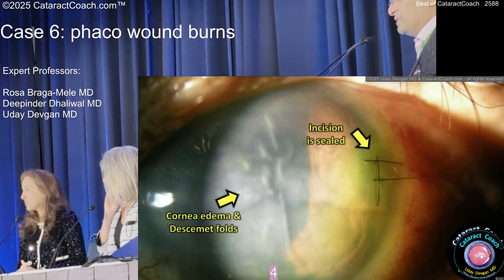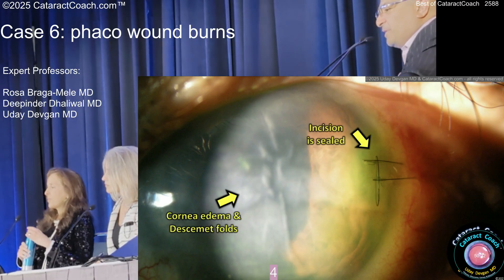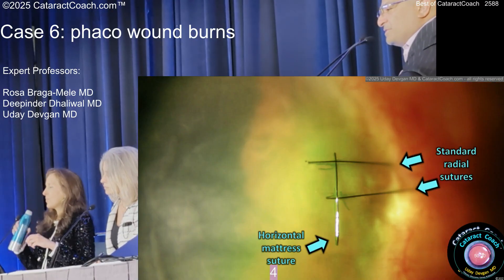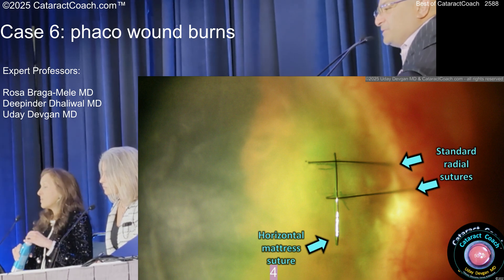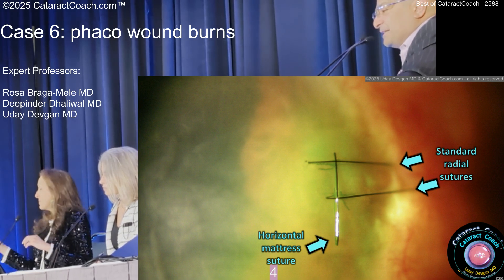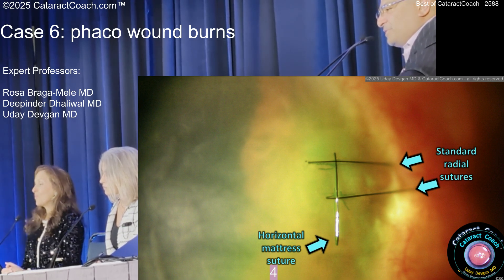There's the sealed incision — there's that horizontal suture, which is super important to bring the roof of the incision down to the floor. That really is a key suture. Only three sutures are required to seal it, and you can see all the fluorescein dye — checked to make sure it's watertight.